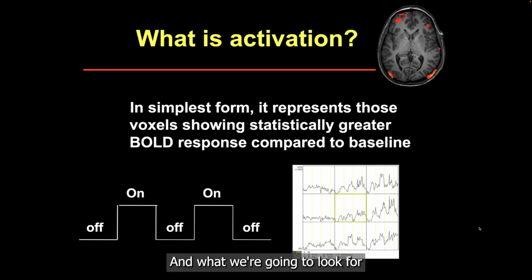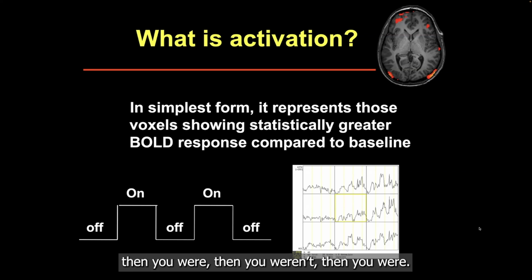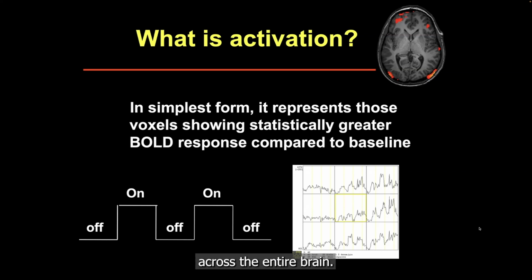And what we're going to look for then over this timing, so we know what timing this is. You were not tapping your fingers, then you were, then you weren't, then you were. Now we're going to look for, across the entire brain, where were there blood flow changes that seem to match this timing?